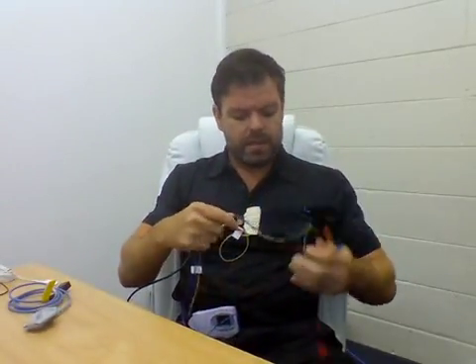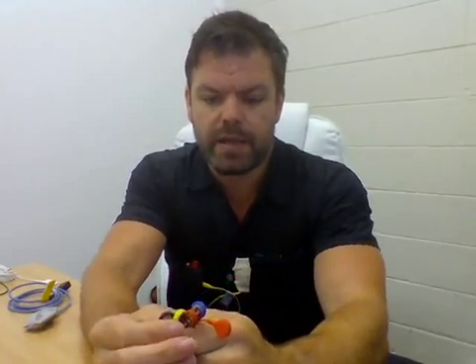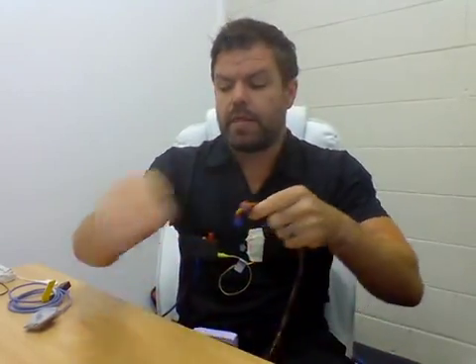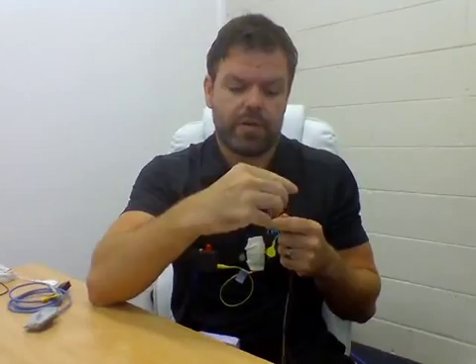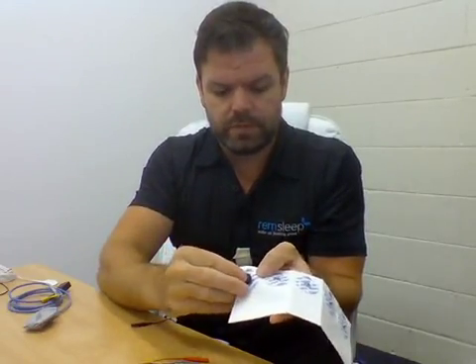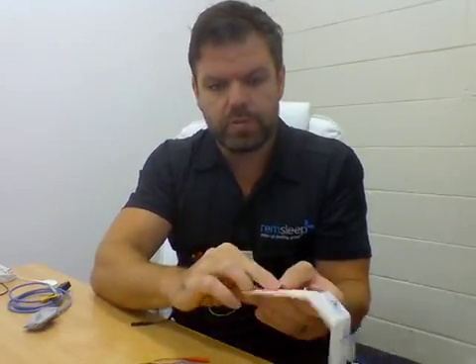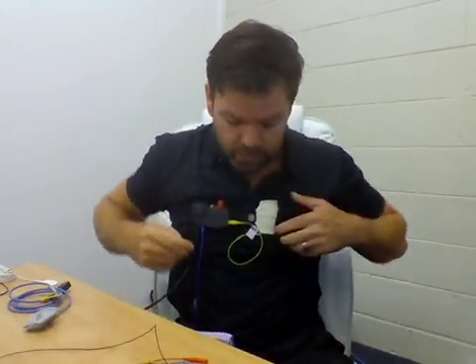Next step is what we call the electrode placement, and these are our electrodes. They're all different colors there. You have a black, yellow, red, blue and orange, and the electrodes on the end of them have a little press stud, and they attach to what we call the electrode pads, which are basically stickers. So we can take an electrode, let's take the black one to start with, and if you press down on the actual sticker itself, it clicks on, and then you can actually peel off the sticker like so, and you'll be placing these stickers on different areas of the body, and that will help us record your sleep patterns, so your brain waves. It will also help us look at your heart, your ECG.